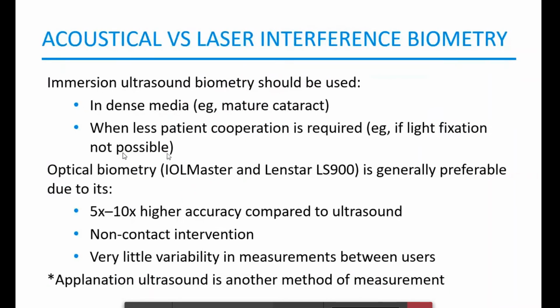The other thing that I wanted to highlight is that recently there has been a new IOL Master in the market. The most recent IOL Master is the IOL Master 700, which is very new in the market, and the previous version is the IOL Master 500. The 500 still uses an infrared laser beam, but the IOL Master 700 uses a swept source OCT. So that's a different kind of instrument altogether, and it's quite new in the market, and it has shown a lot of promise in terms of accuracy in the measurements of the ocular tissue distances.